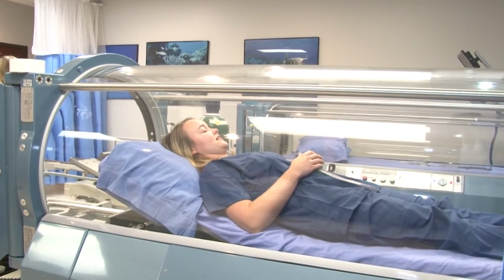I'd love to, before we wrap up our show today, Suzie, for you to give our viewers at home a little bit more about what to expect when you're actually in the machine. Do you hear anything? Do you feel anything? What is it like? You don't hear anything, you don't feel anything. You're actually able to watch movies, videos of your choice while you're in the machine itself. And if I might add one more thing, normally treatments in the HBO machine are 2 hours. And we like to do it at least 4 times a week, if not 5 times a week. We just get a better prognosis that way.